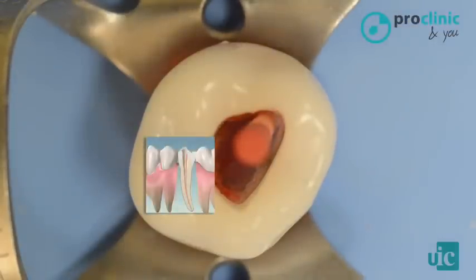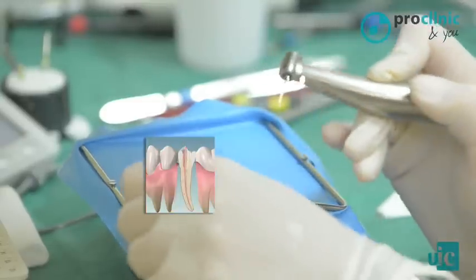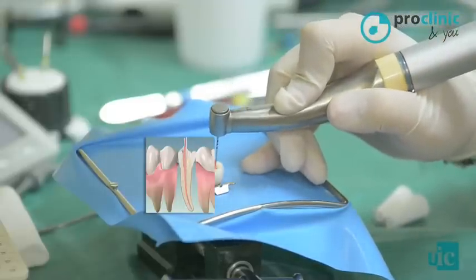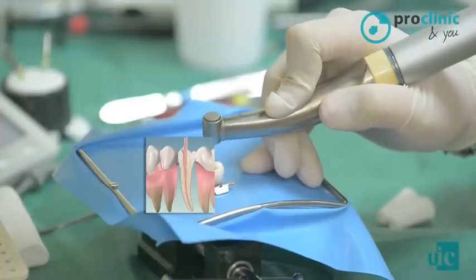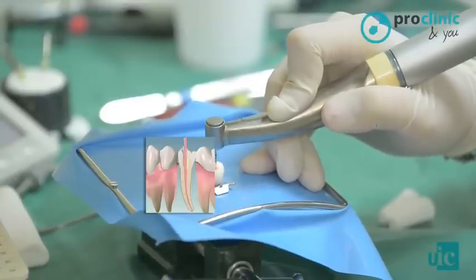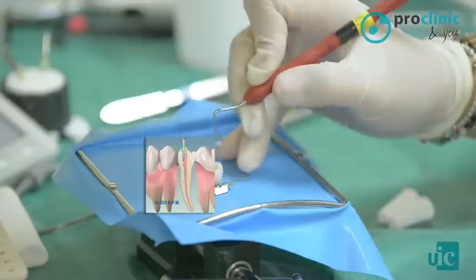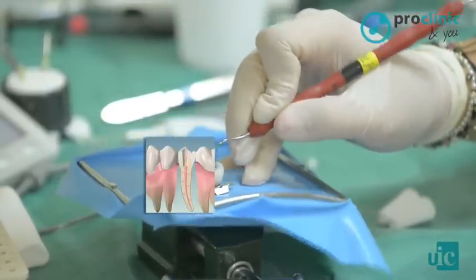Before introducing the gutta percha condenser, we are going to check that the rotation direction goes forwards. We introduce it doing apical pressure to help the gutta percha compaction, so that the gutta percha is compacted. Once the filling is made, we compact the gutta percha apically.